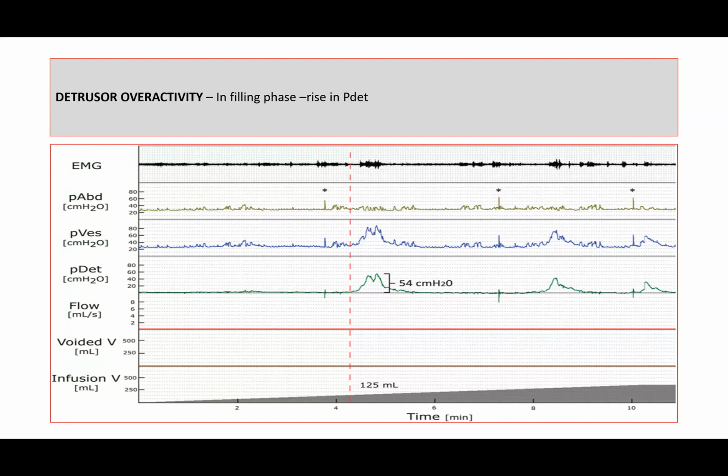Again, whenever we see a graph, we will see the calibration. Okay, 0 is not mentioned, but we can assume this as 0, because there is 20, 40, 60, 80, so most likely this will be 0. The calibration will be set at 0.